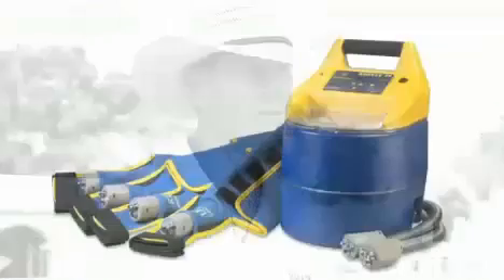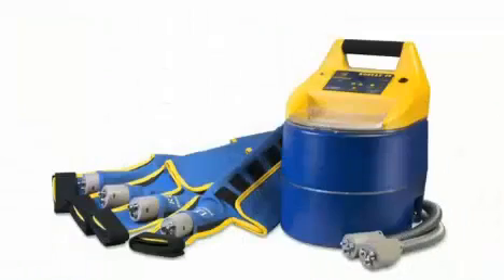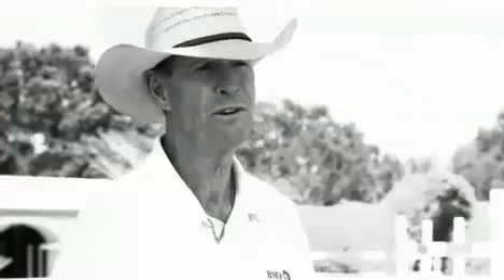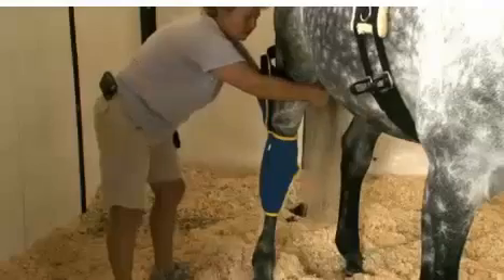The Aureus is another great tool for doing that. With the Aureus pulling machine, in one 20-minute application, you get the inflammation out. That is dramatic.